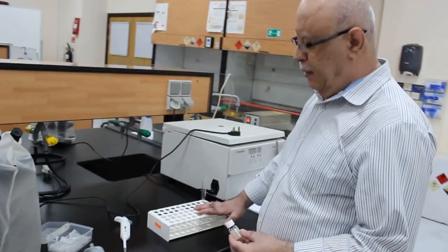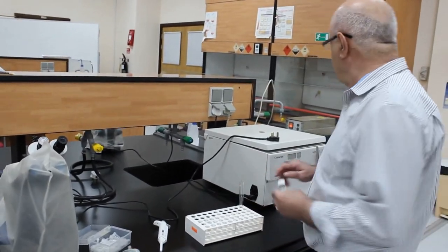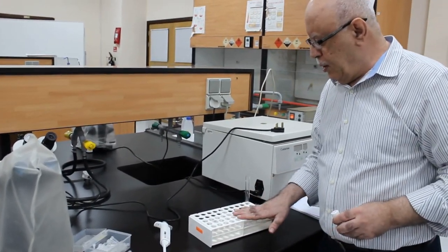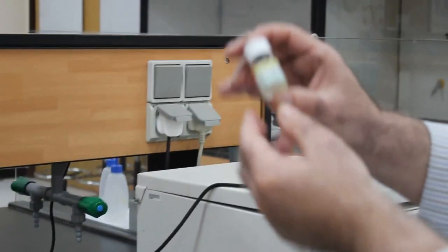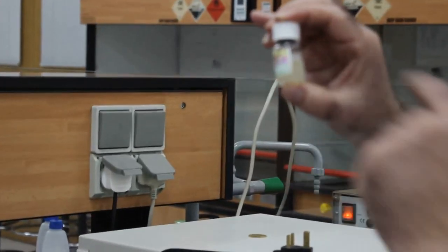This is the experiment. We're going to do PT. We're going to do manual PT only to show you whether we clot or not. Now, we have the reagent. Guess what's in the reagent? Yes, as I said, tissue thromboplastin in addition to calcium.